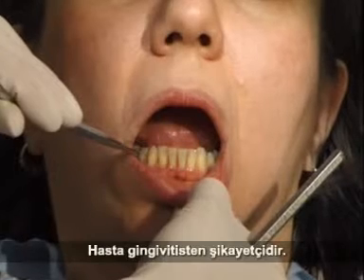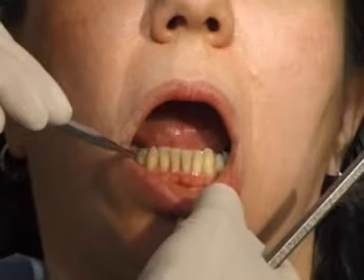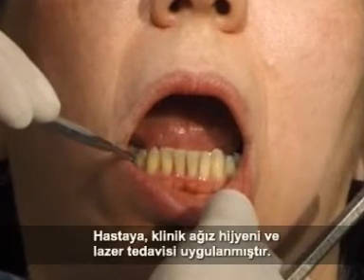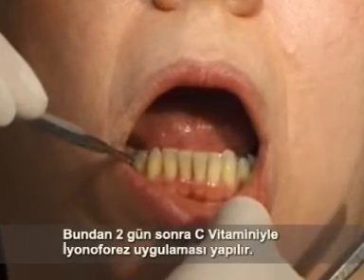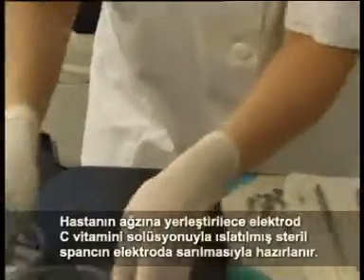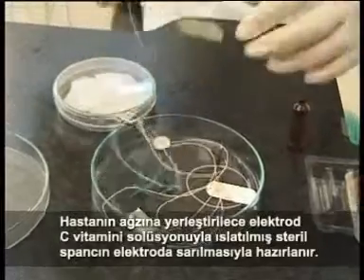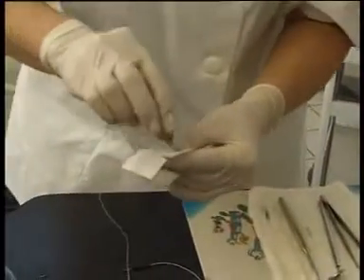The patient suffers from gingivitis. Clinical oral hygiene and laser therapy have already been applied to the patient. Ionophoresis with vitamin C is executed on the 3rd day. The electrode is wrapped up in sterilized lint. Vitamin C is poured onto the lint.